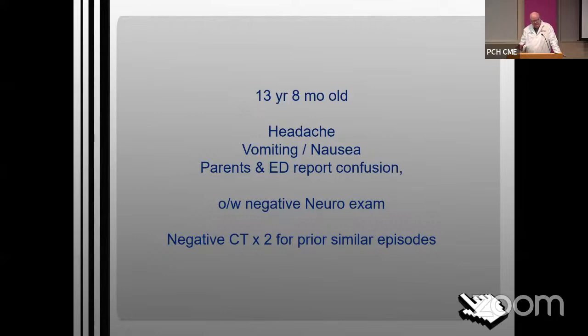And by the way, it's not necessary to get a CT in every acute case. We do have the facility of a rapid MR. That's an MR where none of the sequences are longer than 30 seconds. And it's very useful because by and large, the kids don't need sedation and it's done very quickly. The whole scan takes a very short length of time. So if you're worried about a mass in the brain, get a rapid MR. Do not do a CT because that's radiation. And you'll get a clearance that the kid does not have some serious mass in his brain.